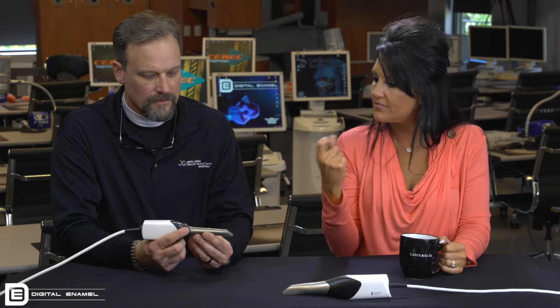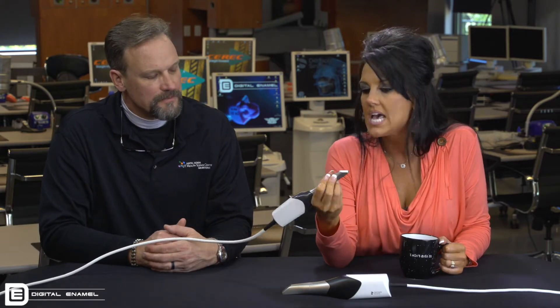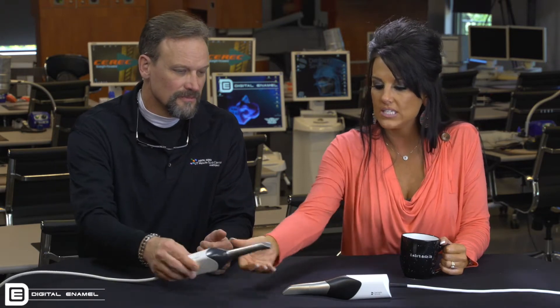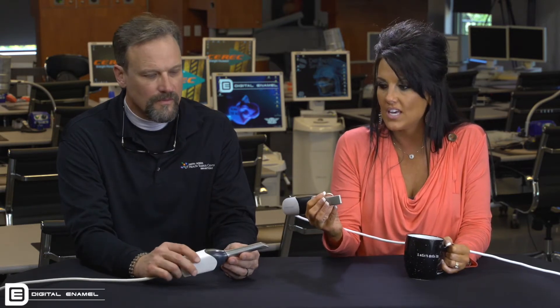...was really the size of the camera. For a female holding it, the ease of use was huge for assistants, female doctors, or anybody with petite, small hands. When I first saw the PrimeScan, I thought, oh my goodness, it's so much bigger. But what this camera sees and the ease of use — it is awesome.